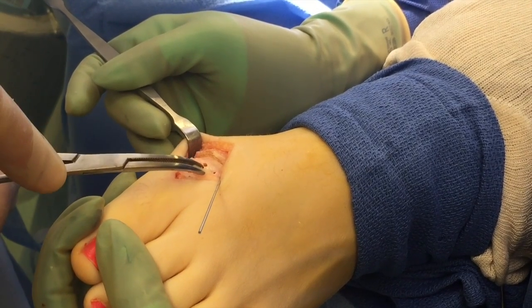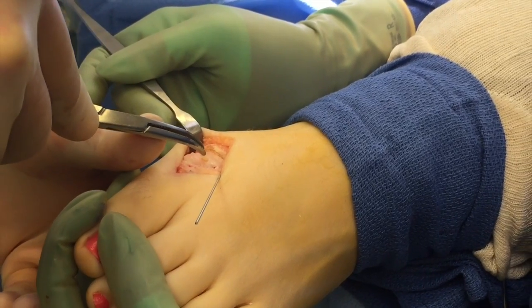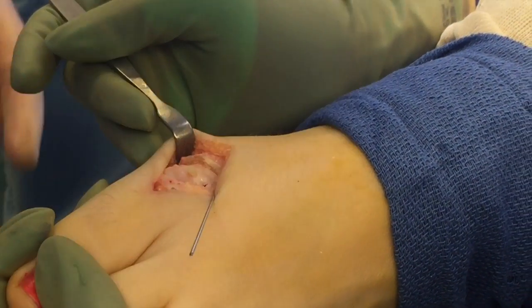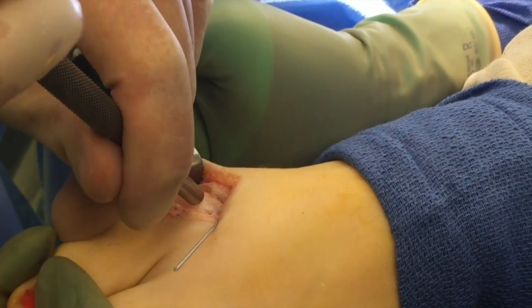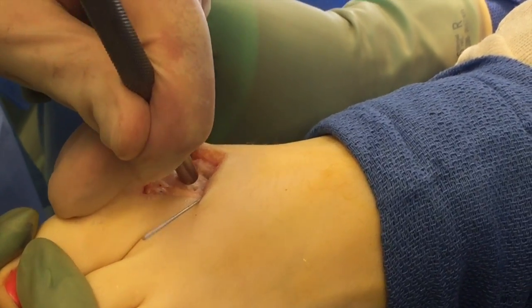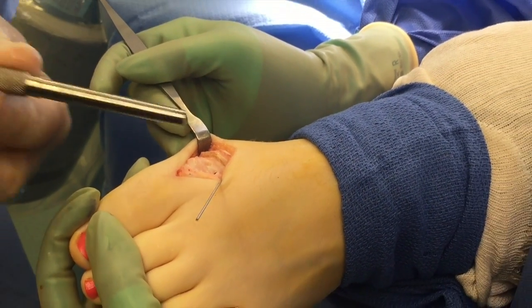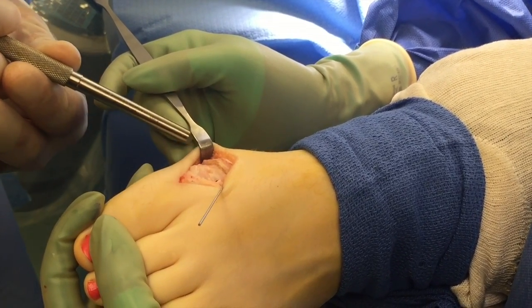We have both the portals drilled — there's one over here and there's one over here. I start the pin like this with the hemostat, and once I get it going and press down into the portal, it'll hang up on this fin. So usually, especially when it's a tight fit, I follow up with the tamp until it's flush with the bone. It's non-metallic. We'll remove this wire after I put the other one in — it's flush with the bone, it'll be absorbed into the bone, and that's it.